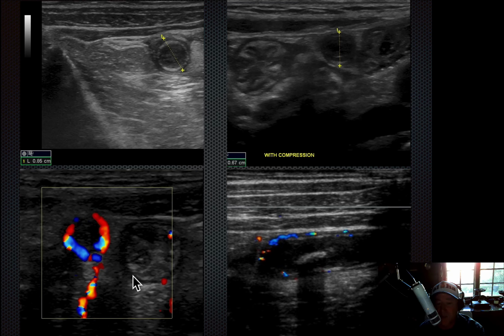This is interesting because you can see the terminal ileum adjacent to the appendix here. That's your landmark. The terminal ileum has a very characteristic look, like a flower for some reason. And here's your 8.5 millimeter appendix over here. It still has its walls, and definitely has some periappendiceal fat on this edge of it. In fact, down here you can see some periappendiceal fat, this hyperechoic stuff. Here's another example.